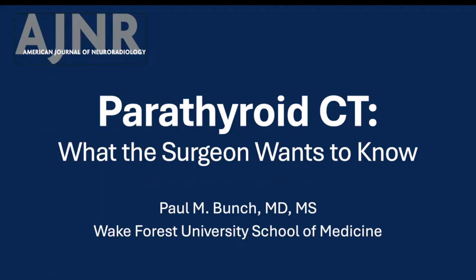from the radiologist when referring a patient for parathyroid CT. I believe that by understanding a little about the surgical perspective, then we can spend more time assessing what matters to them on the imaging and less time worrying about what doesn't.